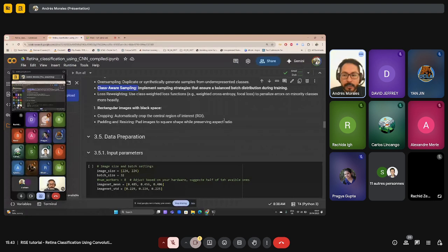So with this, we are done with this exploration of the data, and we are ready to start with the data preparation.